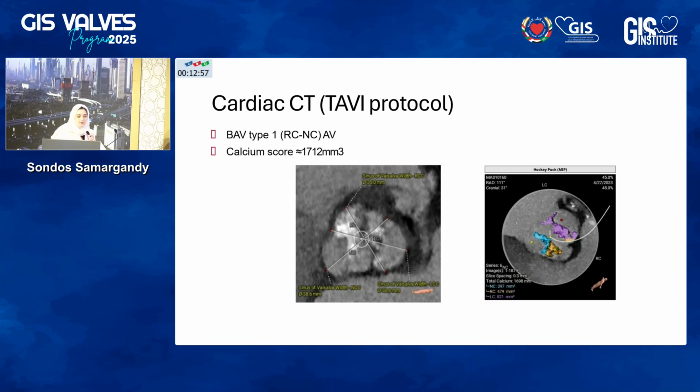Okay, so we move to the CT for the case. What are your thoughts, Dr. Ahmed, since you are our CT imager? So this is what I mentioned: if you see, the calcification is really eccentric and it is facing more the right coronary artery. So if you put a valve there, there is a risk, around 10, 11 o'clock there, the calcification, you can push it to the right coronary artery.